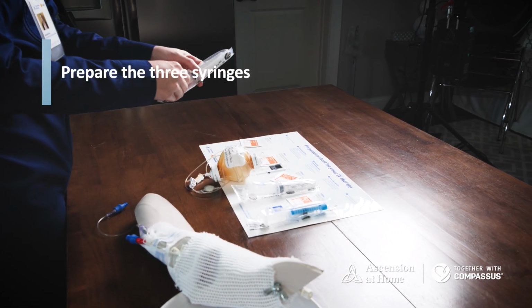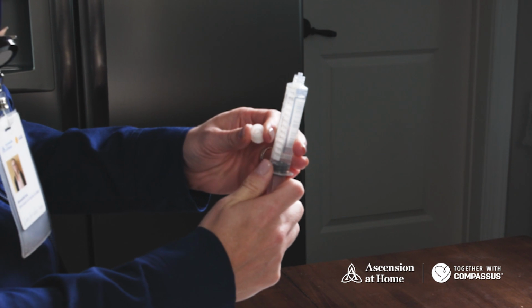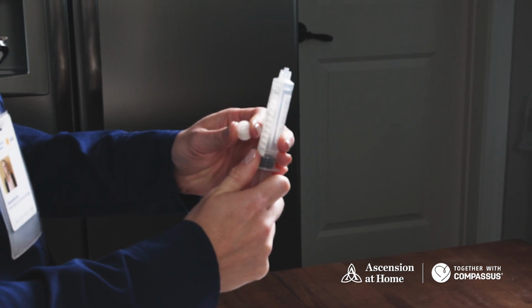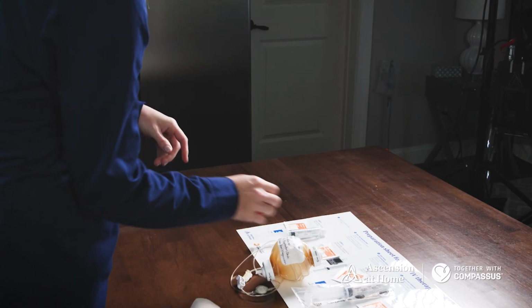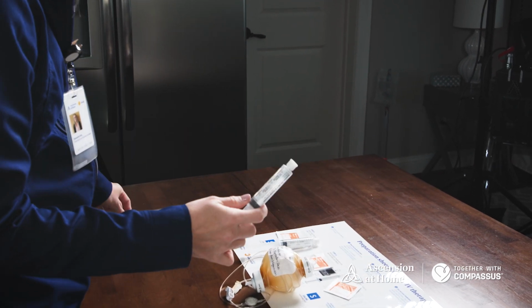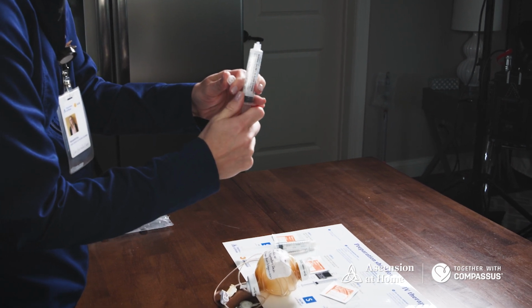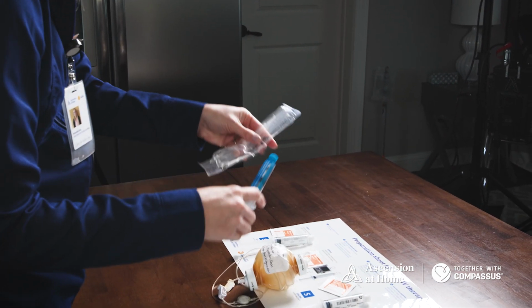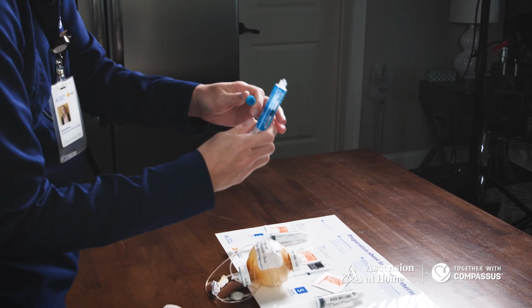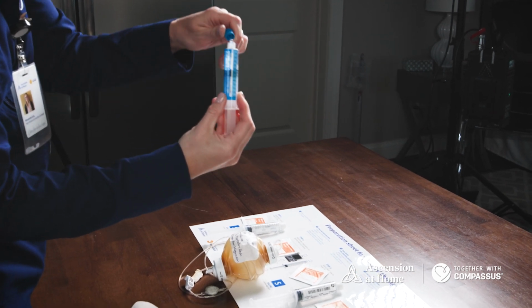On both saline syringes and the heparin syringe, remove the plastic wrapping, remove the cap, hold it vertically, and pull back on the plunger to loosen it. Once loosened, begin pushing the plunger to remove the excess air until you have a small amount of saline or heparin on the tip of the syringe. Then replace the syringe cap. Be careful not to touch the tip of the syringe or the inside of the cap. When finished with the syringe, place it back on the clean work surface. You are now ready to begin the SASH process.